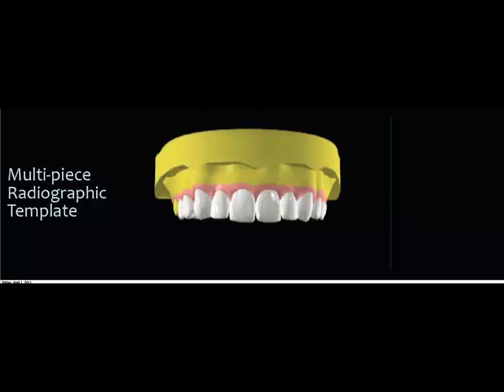And then we're going to use something that all of our kids have, a Lego piece. That Lego piece is very inexpensive and very accurate. And it's going to help put everything back together. Then we're going to use a round burr and prepare our radiographic markers using Cavit or gutta percha. And we want to make sure it's only on the base portion, including the flange area.